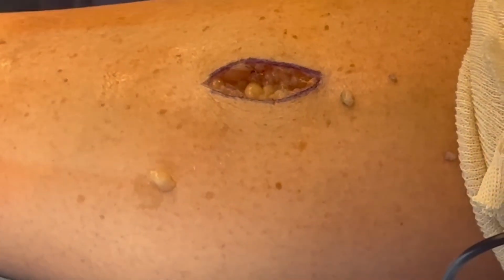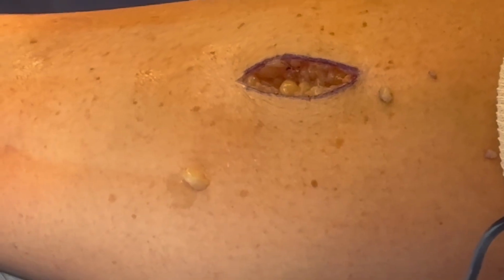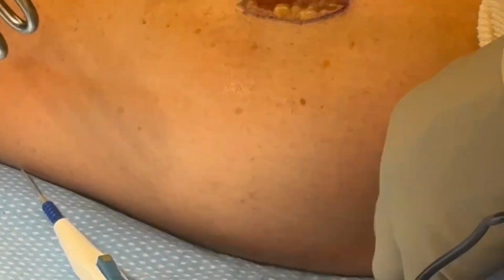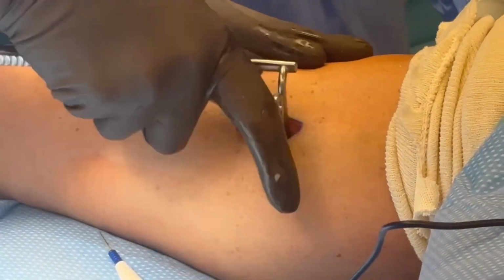I like to feel along the soleus side and try to identify the plantaris tendon, which acts as a tether. And once you identify it, I'll pull it out and release it with some Metzenbaum scissors. This has been shown to give you 9 degrees of dorsiflexion by itself, just releasing that.